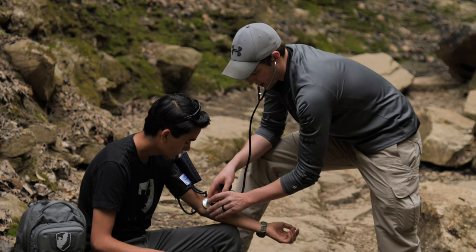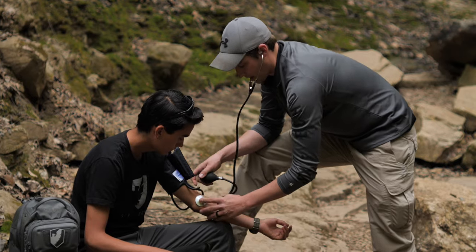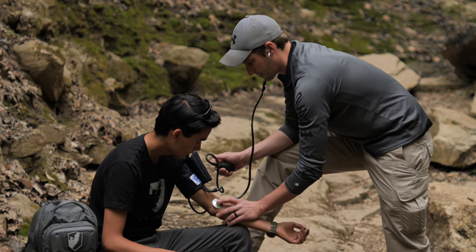If the sound resonates all the way through the bone, you know the bone is connected; if it's separated, you won't get that transmission through. That's not as commonly used but still an option. The most common use for a stethoscope is probably to take a blood pressure — a basic vital sign that everyone should understand, and one reason I think you should have one in your home medical kit.